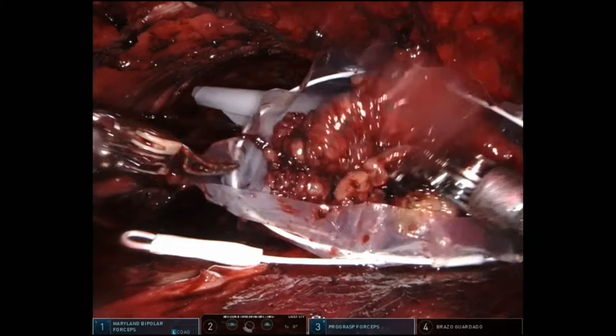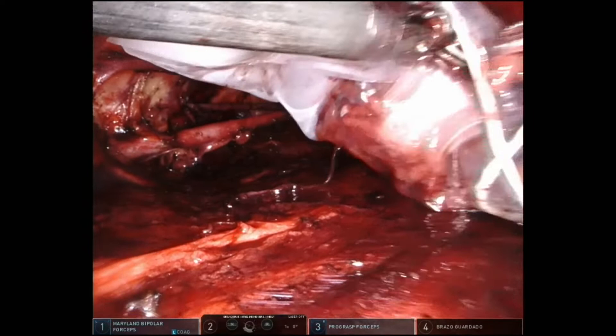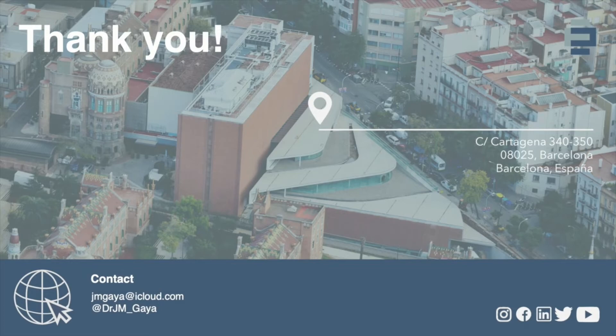I place the specimen in the bag and remove it through the camera trocar incision - where I had the bigger incision. Then I place a drainage for at least one week. It is forbidden - nurses and residents know - to remove the drainage before three days with less than 20 cc per day. If you remove it before that you will have lymphorrhea, lymphocele, and then will need to place another percutaneous drainage.